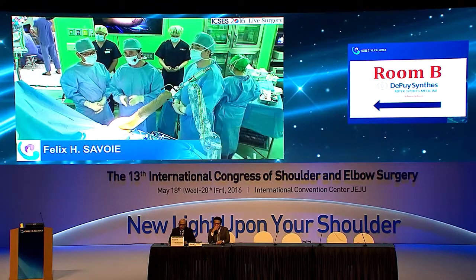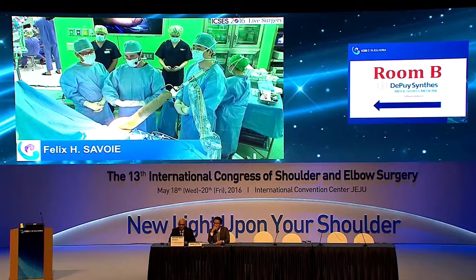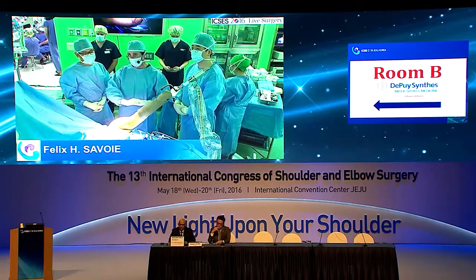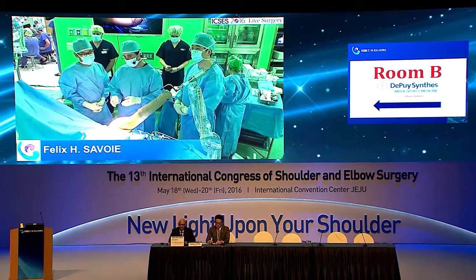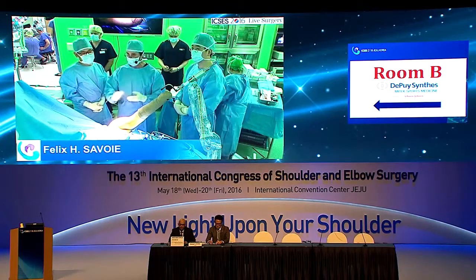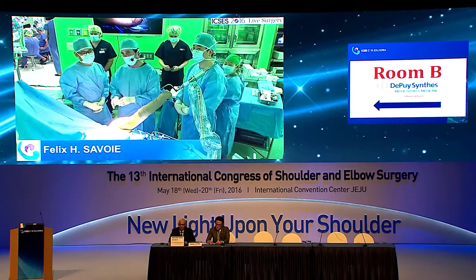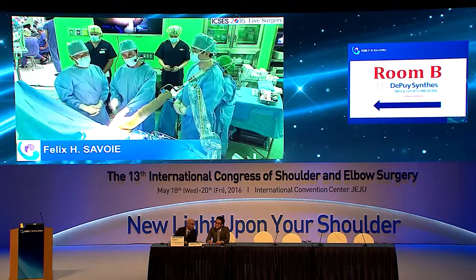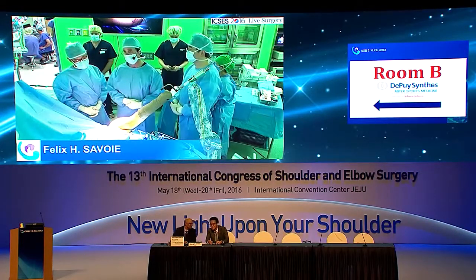If you have a loss of tendon, the biggest mistake you can make is to try to do a 4-anchor repair and pull that residual tendon all the way over to the lateral side. We were lucky here. Our undersurface could only go just off the articular margin, but the superior surface could easily come over the top, so it looked nice. But if that top part had torn, and I still had a centimeter of tendon, then that entire repair would be a centimeter medial.